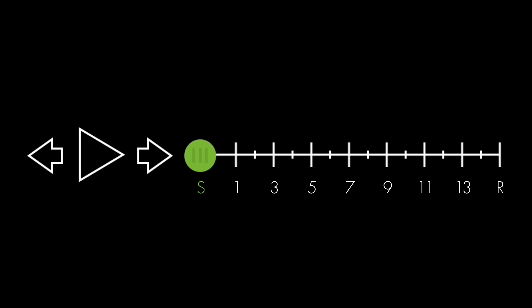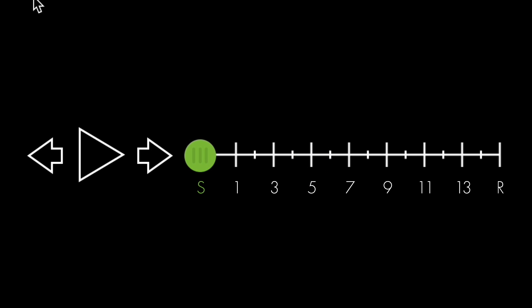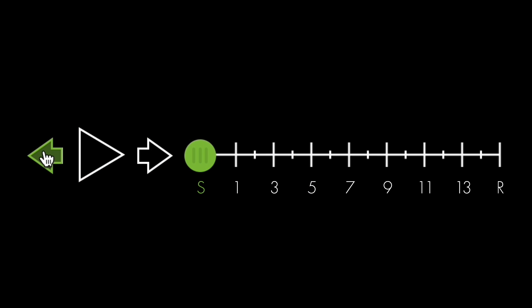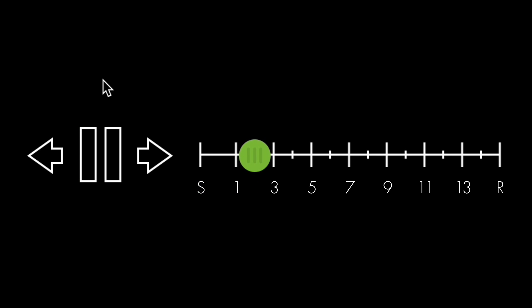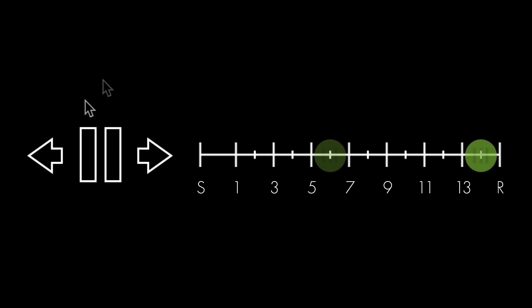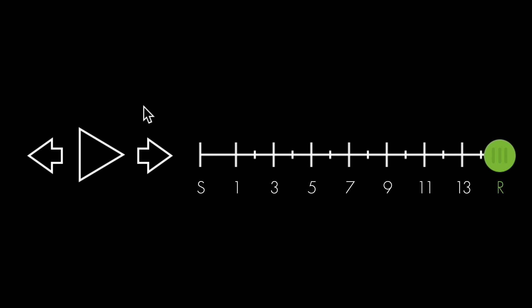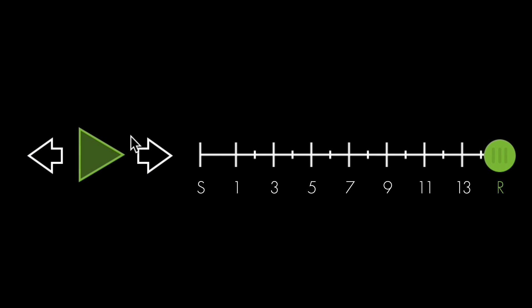To navigate between steps, you can drag the slider, click on a step, click the previous and next arrows, or click play to animate the treatment from beginning to end. You can click next at the end of treatment, or previous at the beginning, to quickly toggle between views before and after treatment.